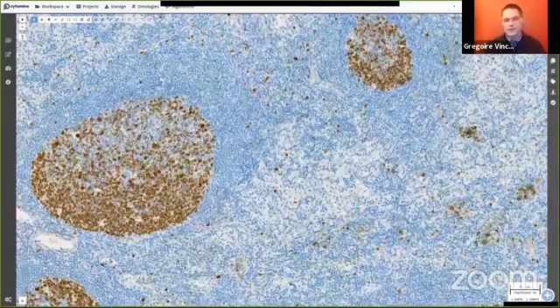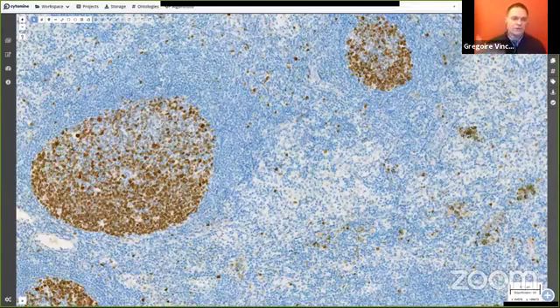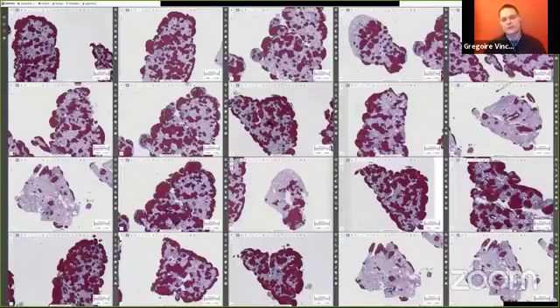So here, for example, the game gets simplified by the use of a coloration, which colors in brown all the nuclei of the cells where a specific gene is expressed, for example. And you also need to have a lot of data. A lot of data means a lot of high quality images, but also a lot of annotations to train this AI to be able to recognize what you want it to recognize afterward. It can be segmentation of zones like here, where some inflammatory process may occur, but also tagging of cells and so on.